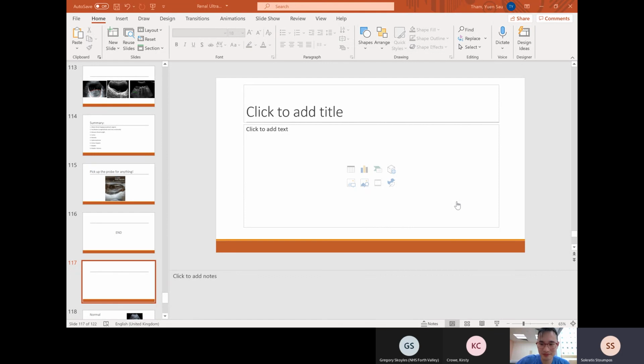I think it's all good. So the one thing we've not covered is how we save the images, and that would be useful to further discuss. I think we can do that in the live demonstration, can we? Or saving that for the live demo. I think there's not much utility in doing it here. It'd be easier to show on the live demo, so I'll do it.